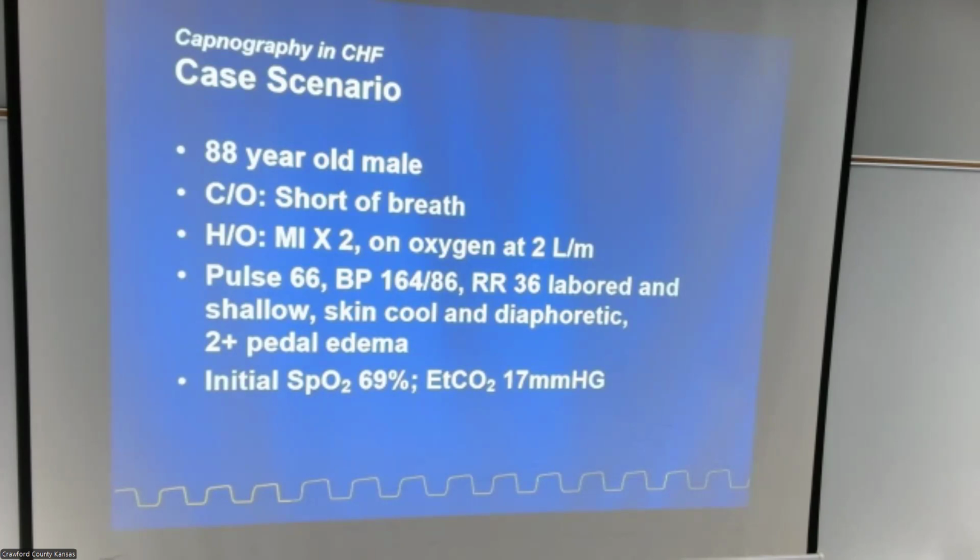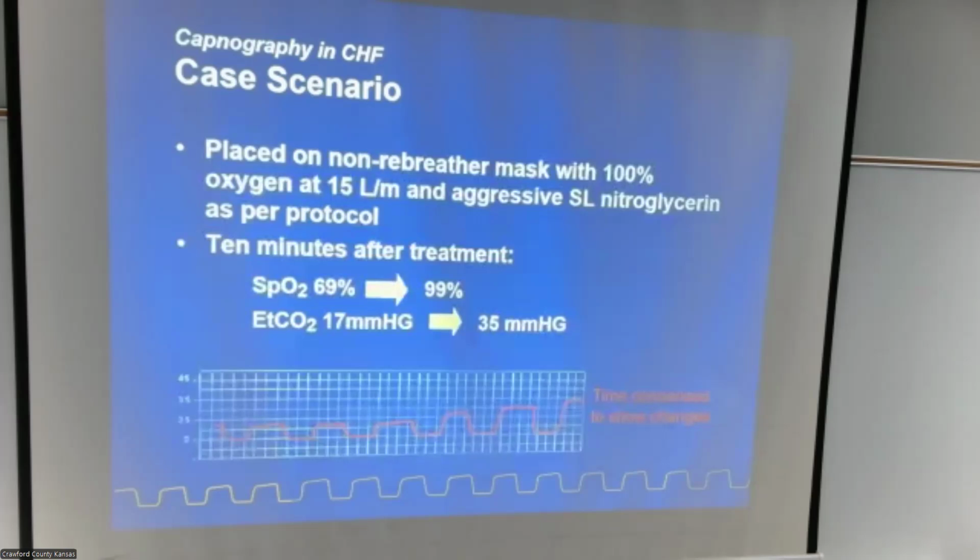His end tidal is low. What's your first thought of his end tidal being low? One of two things comes to mind. Either we have a cardiac episode that's severe, or he's got congestive heart failure. With the pedal edema, I lean more towards CHF. So place him on a non-rebreather mask with 100%, 15 liters, and sublingual nitro. You can turn him around from 69 to 99. His end tidal CO2 went from 17 to 35. Pulmonary edema.